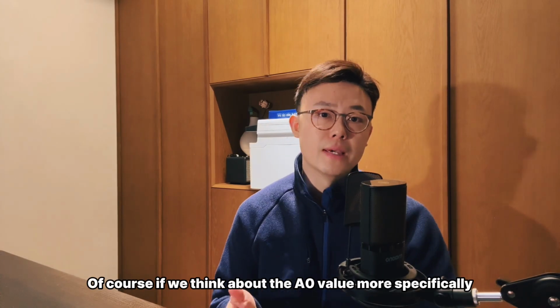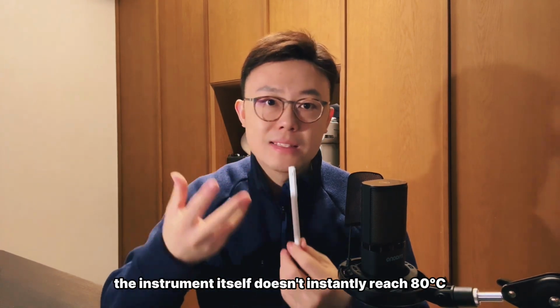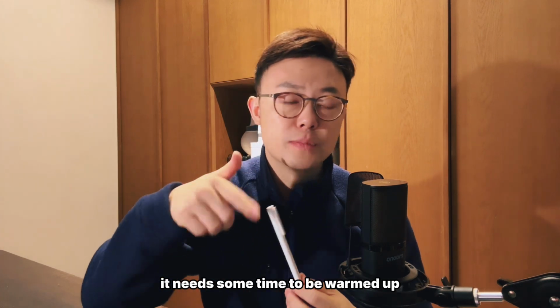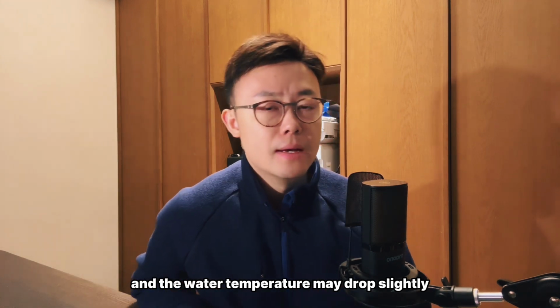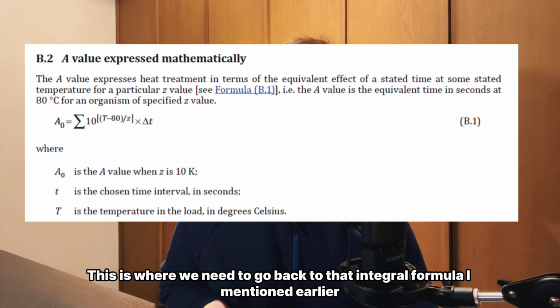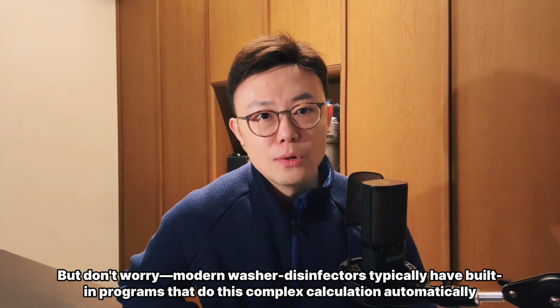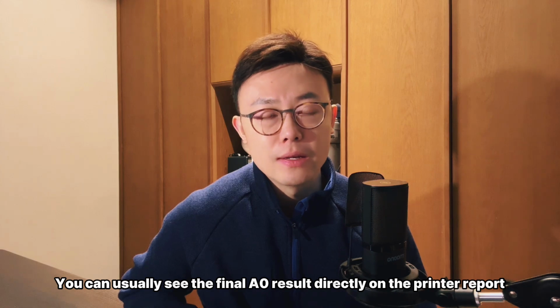Of course, if we think about the A0 value more specifically, when an instrument is just placed into 80 degree water, the instrument itself doesn't instantly reach 80 degrees. It needs some time to warm up, right? And the water temperature around it may also drop slightly. So at that moment, we can't simply calculate the A0 value based on time alone. This is where we need to go back to the integral formula I mentioned earlier. But don't worry, modern washer disinfectors typically have built-in programs that do this complex calculation automatically. You can usually see the final A0 result directly on the printer report.